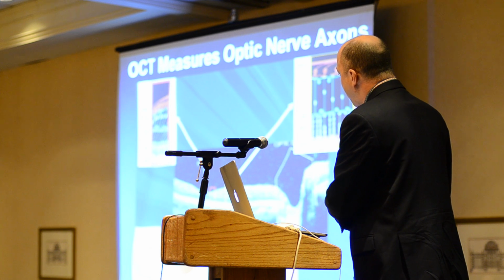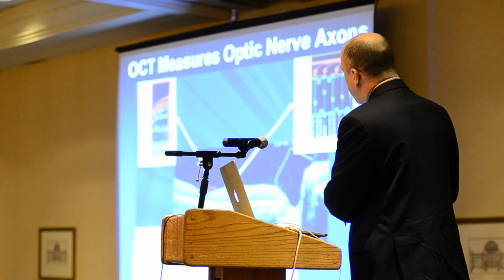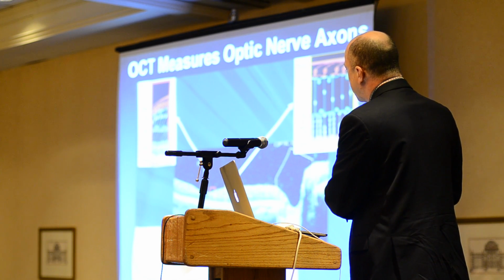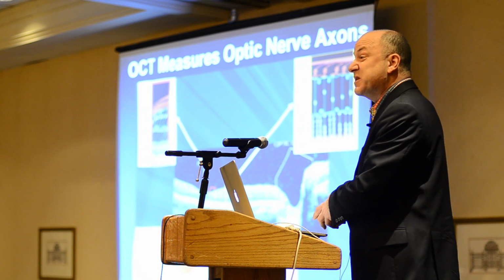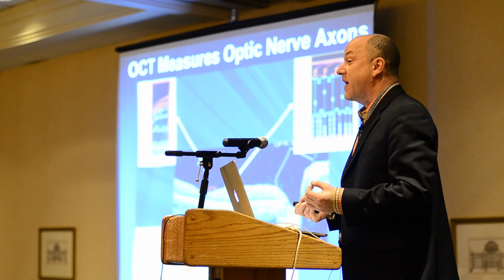And so when we have this look back here into the retina, in which the very top layer of the retina is all the cables that are composing the optic nerve, in this image from OCT, we're seeing those cables without the white matter.